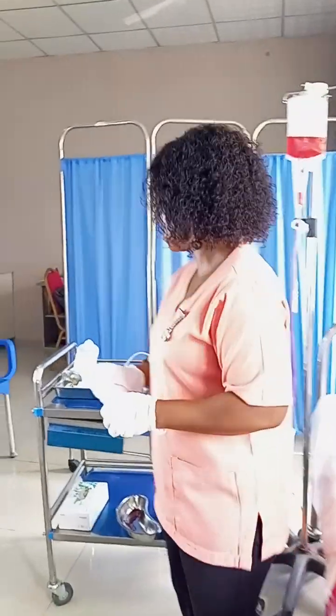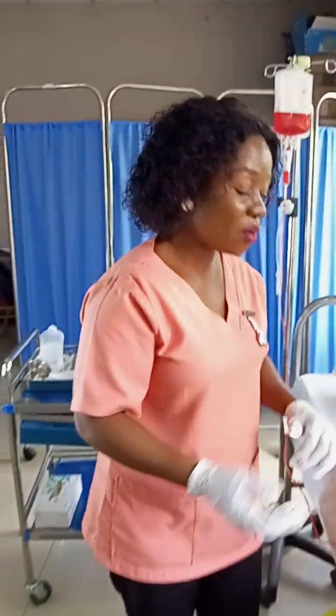You keep checking the patient's vital signs every 10 minutes or 15 minutes, depending on the patient's condition. So I assume I am done checking the vital signs, and we are done transfusing this blood.